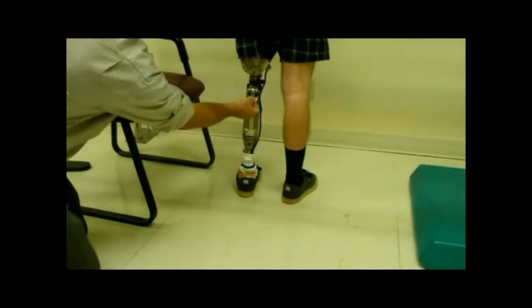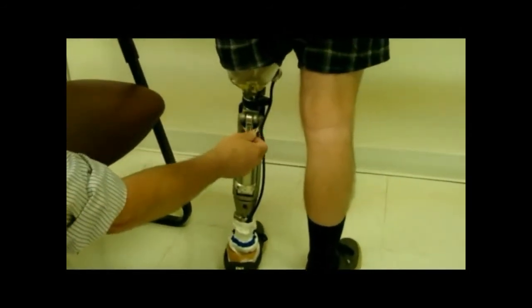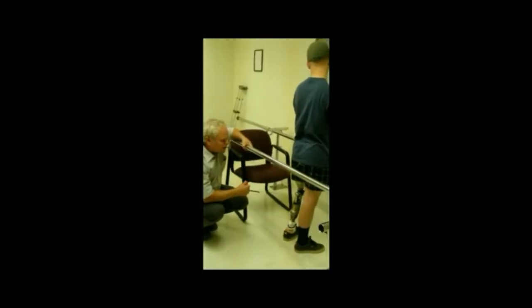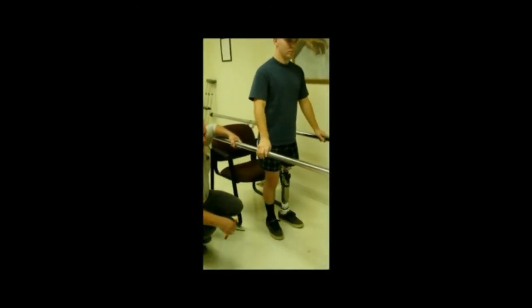Make it easy. Heel rise size is this little toggle up here, and it's a slide. You just pull it over. Right is easy, left is firm. Let's watch you walk, and let's watch the heel rise. Try to compare it to the sound side.